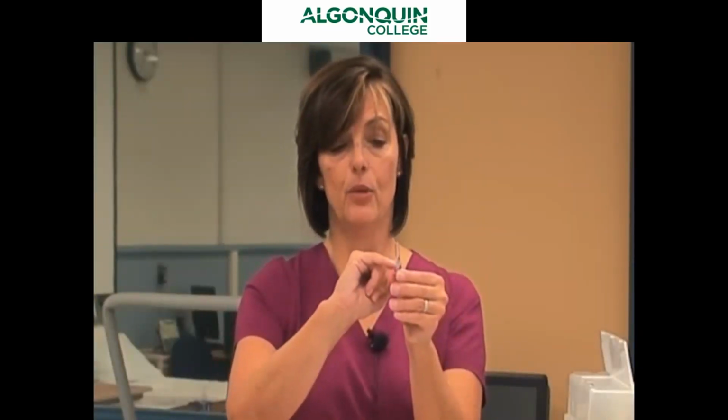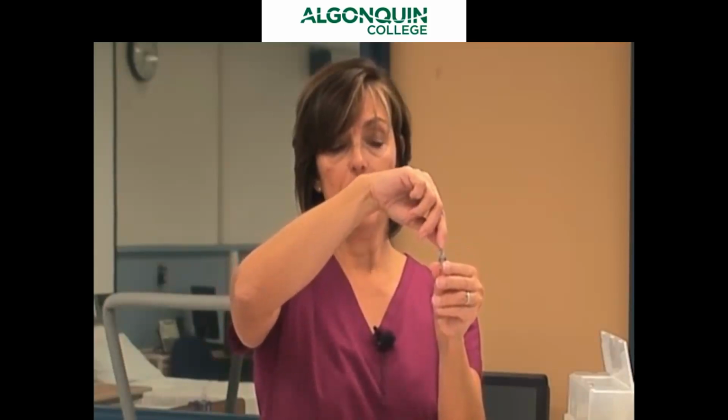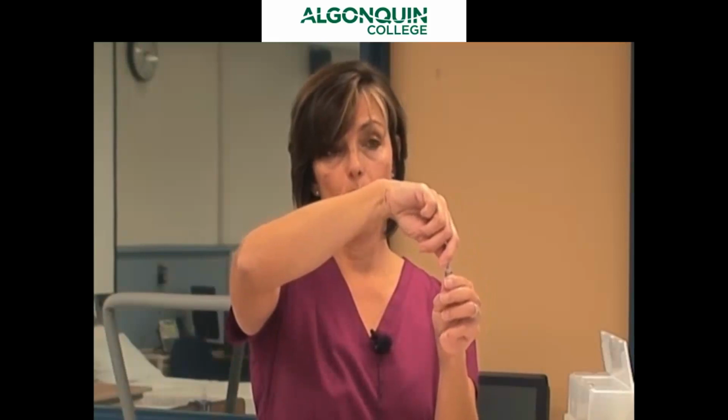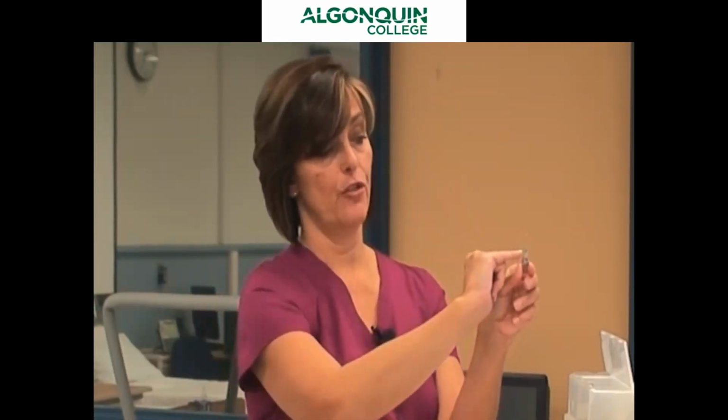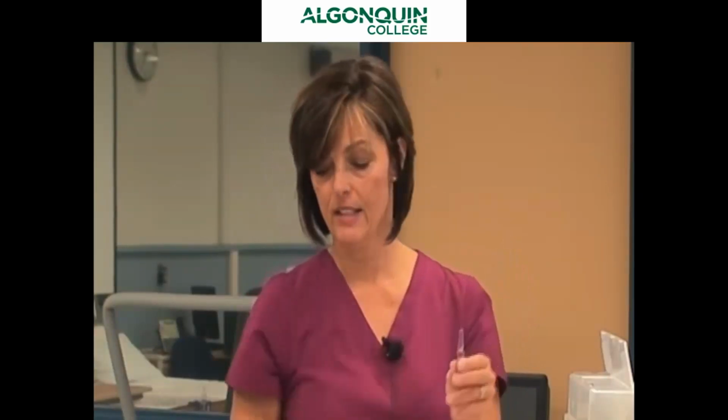The ampoule has a scored ring around the neck of it, and it's usually quite colored. Here it's blue, and it needs to be broken open and away from you. One way to do that is to just snap it away from you, making sure that your thumb and your fingers don't touch the broken glass portion.